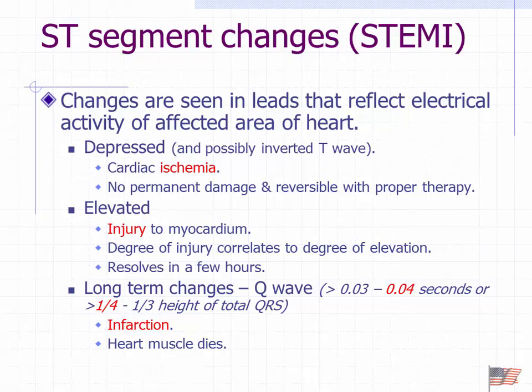My mother had 2 silent MIs. They discovered on an EKG that there was presence of a Q wave. And then the next time the Q wave got bigger. Like, how do you know if it's not happening? Could it happen right then and there? No, no. Because remember that arrow? It's got to go through the ischemia, the injury, and then the infarction. Oh, okay. Now, if we don't catch them until the heart's already gone, then that's a different story. That makes sense. But that Q wave develops usually within a few days and stays there forever.